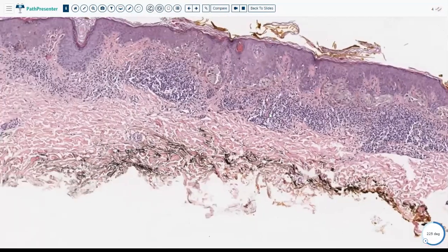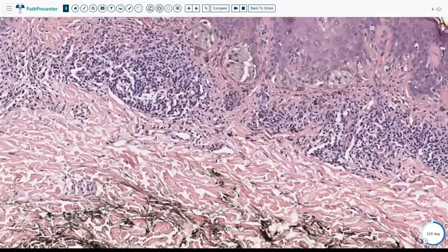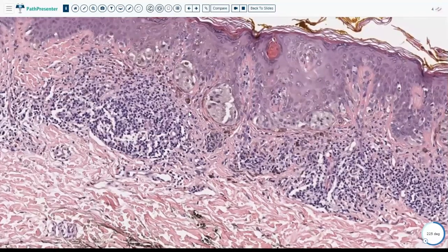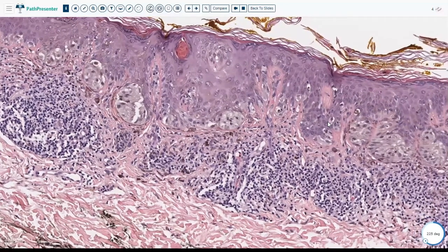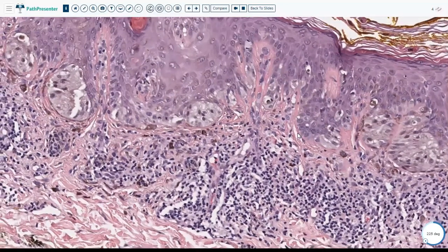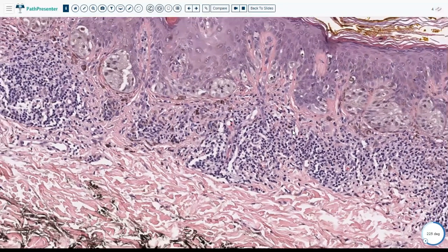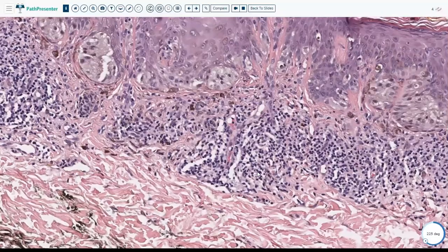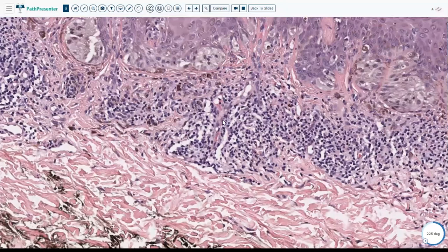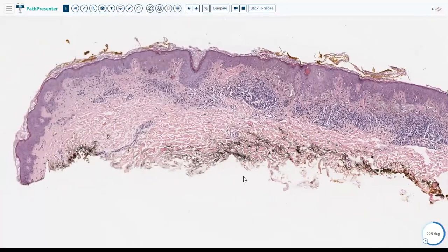Again, another one that is also a dysplastic nevus, mild. You can see here large nests, but always in the tips of the rete ridges, large next to a small nest. There are some single melanocytes in the epidermis, which is always a concerning feature. But when you grade or take any feature into consideration, you should put it in the context of the general picture. You can see here again, there are no nests in the dermis as much as just scattered melanocytes maturing. See how big they are in the epidermis and how small they are when they reach the dermis. These are all features that would tell me that this is a benign lesion.